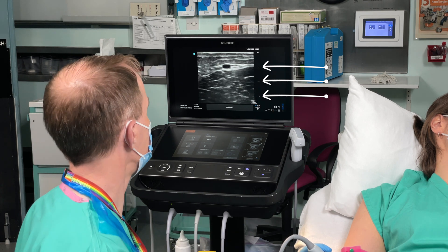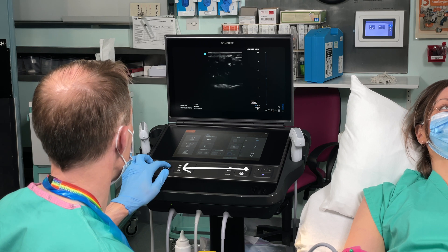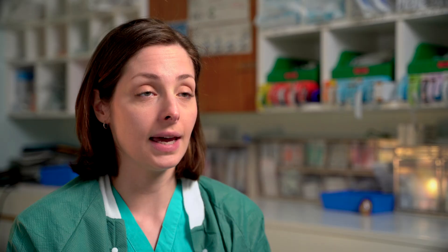You can optimise the image in a number of ways: adjust the depth up and down to get the vessel into the middle of the screen, or adjust the gain to improve picture quality. Bear in mind that as you change depth and gain, you might lose some peripheral structures around your vessel — which can be useful to keep in sight if you are near an artery or a nerve. Consider using local anaesthetic, as you're going to use a bigger cannula and this procedure can be uncomfortable for patients. It's worth using local anaesthetic for any cannula bigger than a pink, and if your patient looks difficult and you may need multiple attempts, local anaesthetic will make this more tolerable for them.